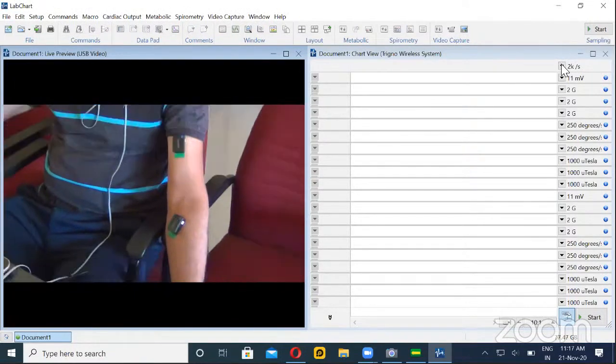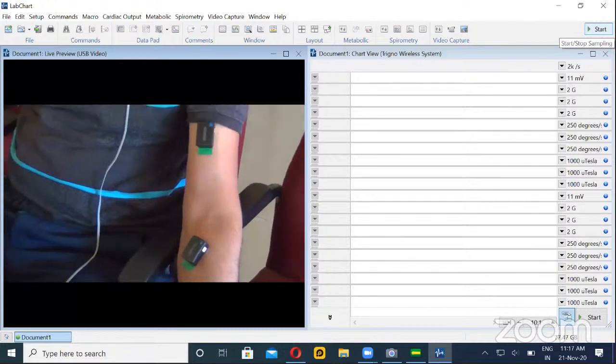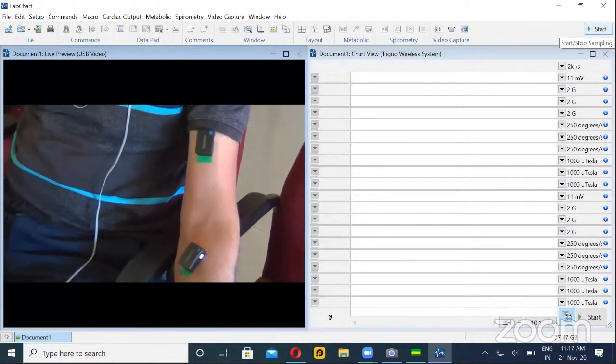Now Sumanth will take over the working. You can see the start button here — this is to start the recording, just like any video recording. Sumanth will explain the other parts. Sumanth, you can carry on.